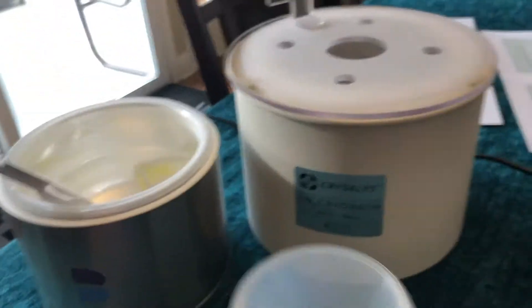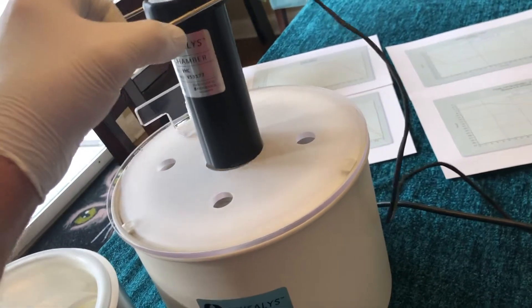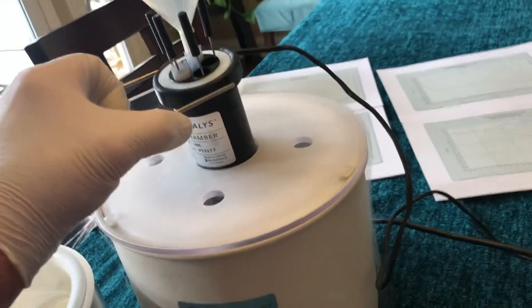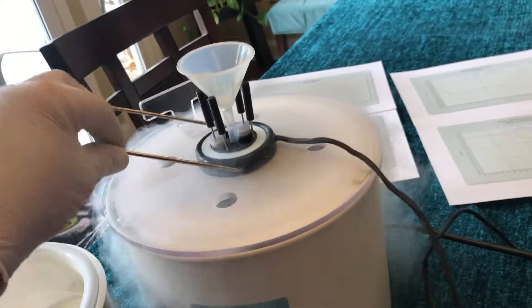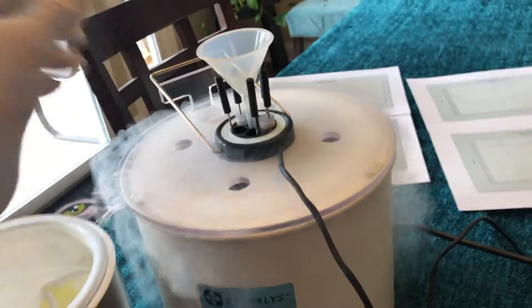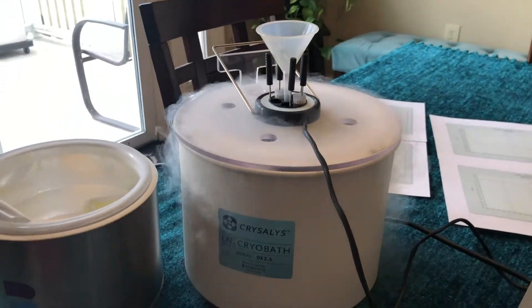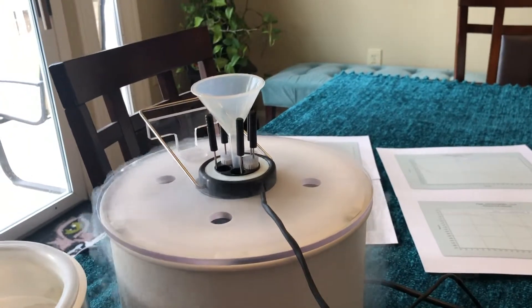If I had three hands I'd lower this chamber into the bath with the T-handle on this PTFE lid. However, I don't have three hands, so let's just put it in here — it's going to get a little upset because it's been at room temperature, so it's going to bubble like Weird Science. Impress your neighbors at Halloween — I'm a goofball at heart.